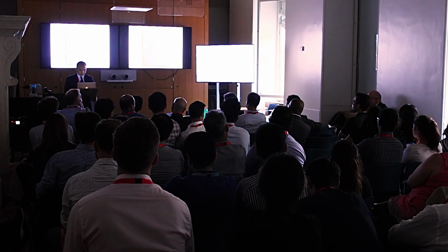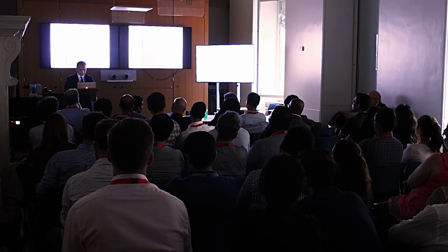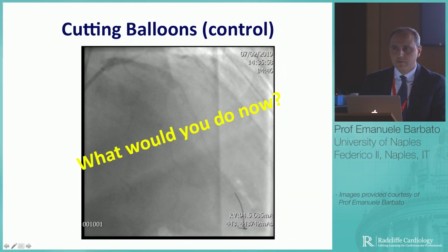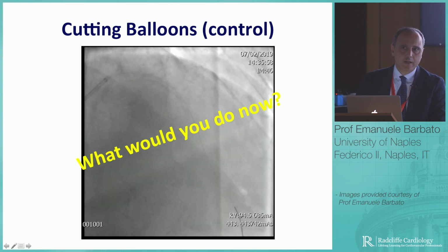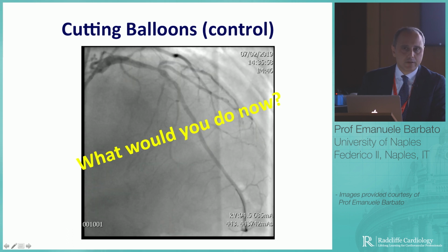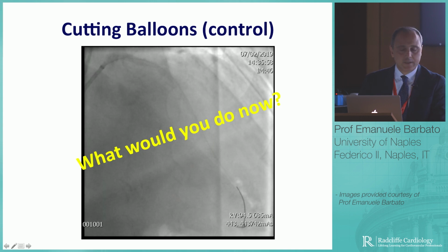Christos, I think I'd like some imaging to understand what's going on. The dissection shouldn't put us off doing more rotational atherectomy. Yeah, actually, these are all fair considerations. A bigger burr is certainly an option. Either taking a new guiding catheter, why not, or just give it a try with a 175 within that one.